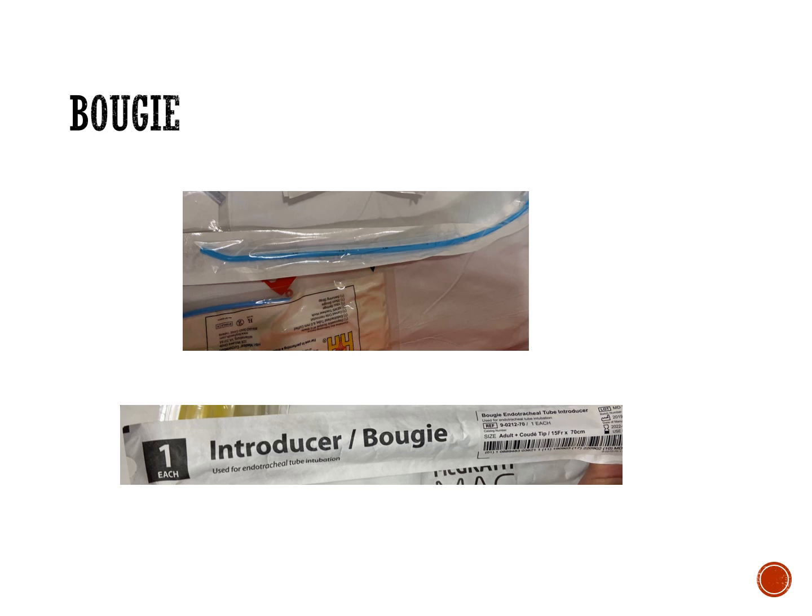So a bougie, or a gum elastic bougie, is about 1.5 times the length of an endotracheal tube. The idea is it has a certain amount of rigidity. It's called a gum elastic bougie because it's rigid, but not entirely rigid. It's also flexible at the same time. The distal end of it is not quite hockey stick shaped, but it has an angle to it.